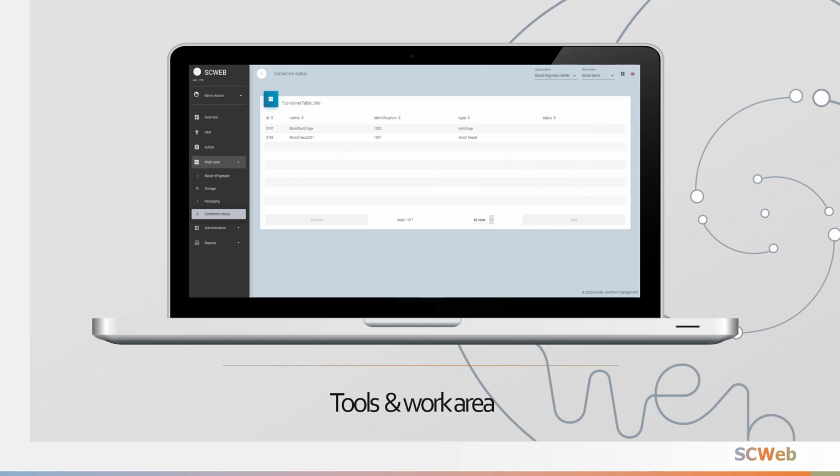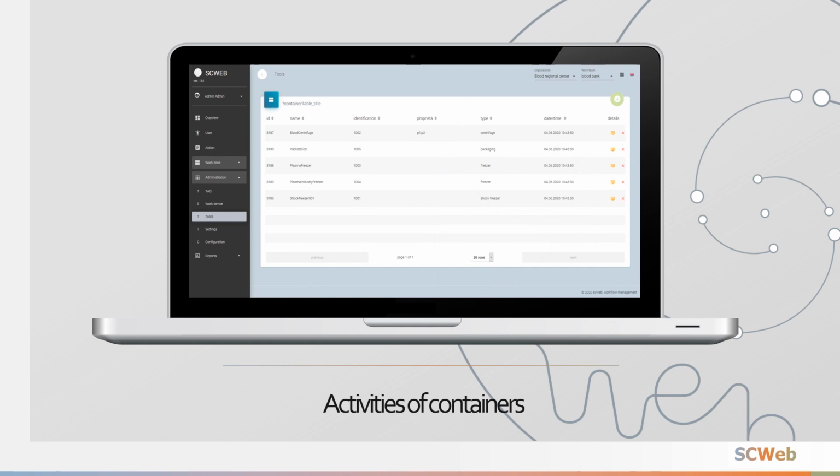Furthermore, every single tool, freezer, blood bank refrigerator, or platelet storage system is matched to the work area where a specific organisation carries out its activities. Consequently, activities such as sanification and preventive or corrective maintenance are also defined for the state of the containers.